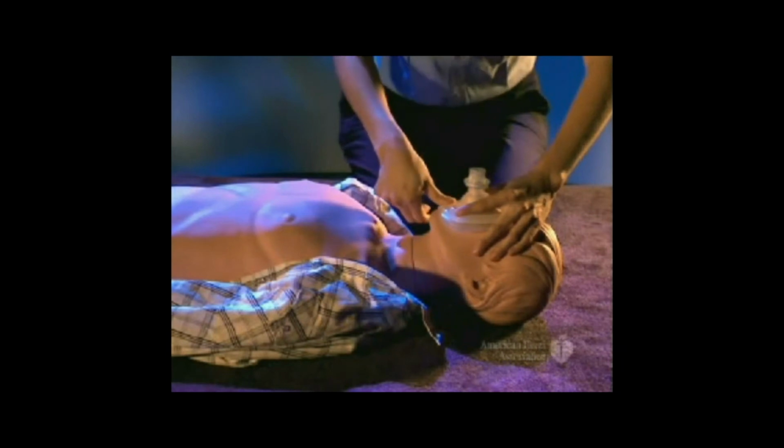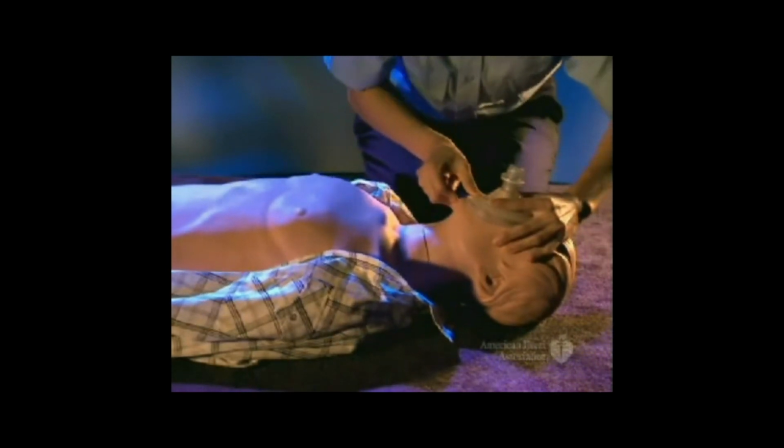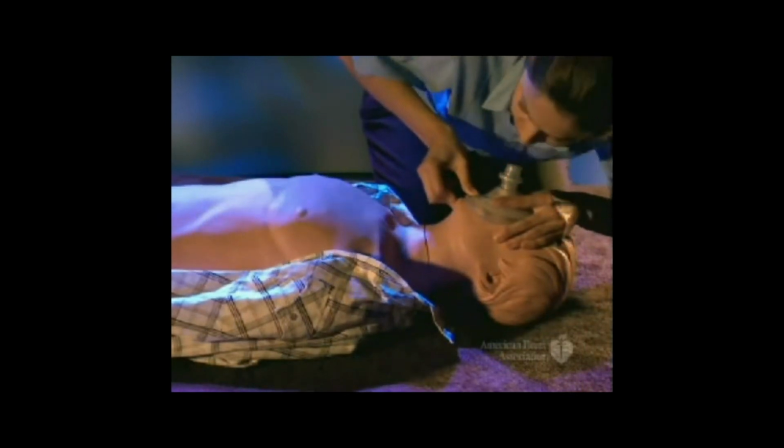Place the thumb of your other hand along the lower margin of the mask. Open the airway using a head tilt chin lift. Press the mask down and lift the jaw to hold the mask tightly against the face, and give 2 breaths while watching for chest rise. Each breath should be delivered over 1 second.